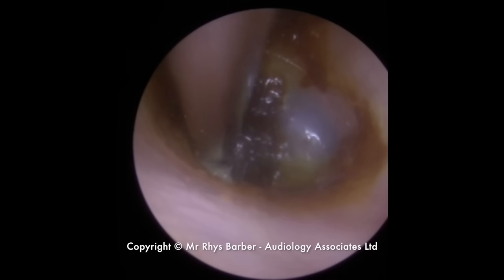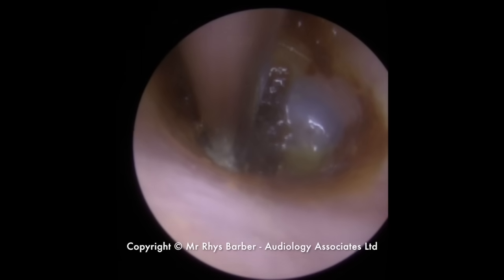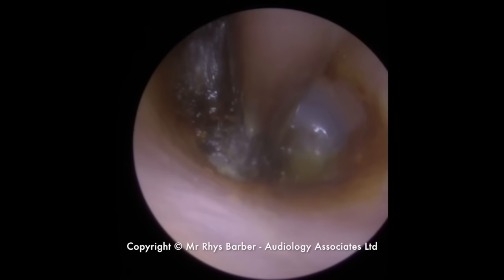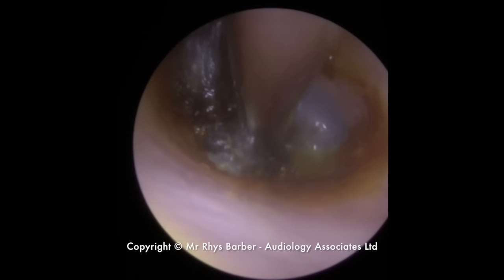Now this is one solid piece of wax. I'm trying to break little bits off and I've got to be really gentle because it's actually pushing up against the eardrum. So you can see the whole thing moving. If you look to the right-hand side, it's just blocked the view there a little bit, but you can see the whole section moving there.